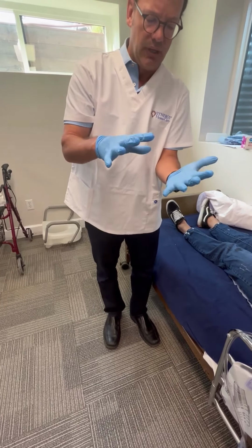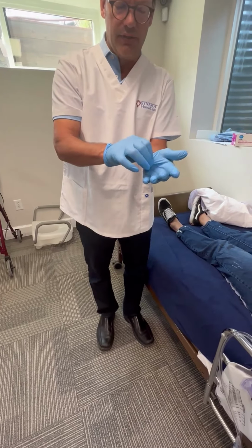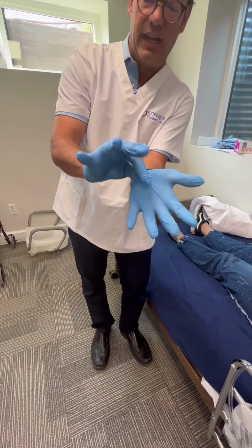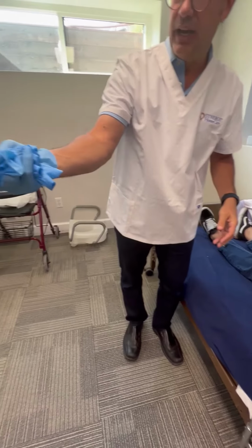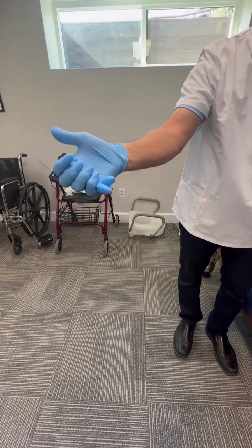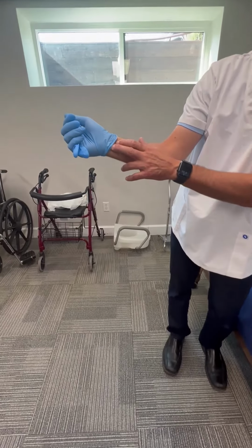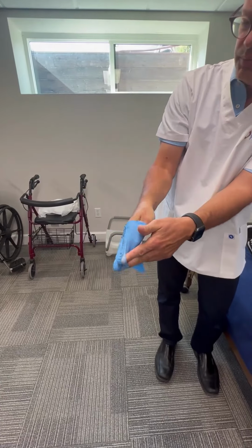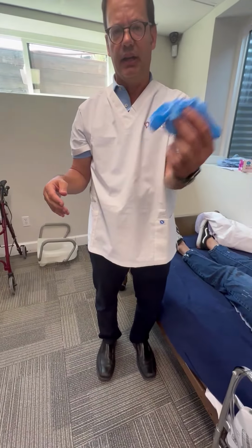If you are finished with your work and want to dispose of the gloves, you'll see I'm pinching the glove with this hand and removing it, and I am going to crunch this glove into my other hand so it is in place in my palm, and then my fingers are going to go underneath the glove and push it forward, and now the glove is off and I can dispose of it.